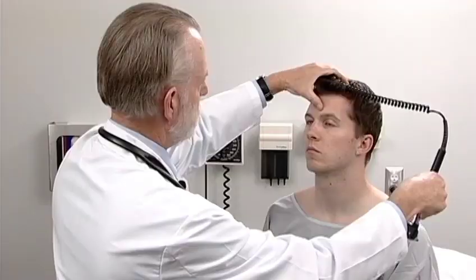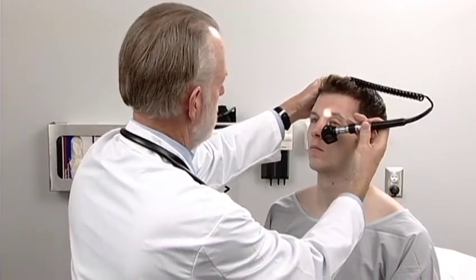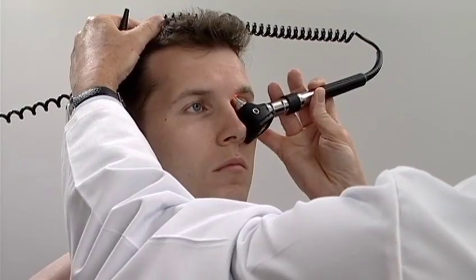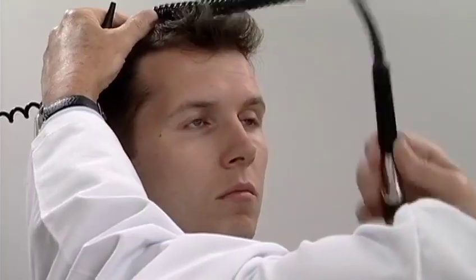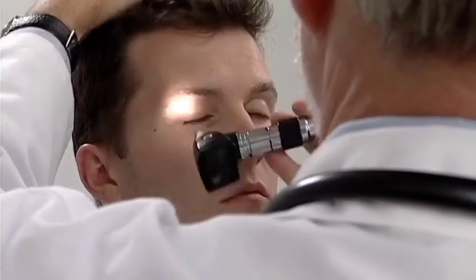Lastly, we can do transillumination of the sinuses. The fiber optic otoscopes are really quite good for this because they're cold and they don't apply heat to the patient. To transilluminate the frontal sinuses, you place the otoscope against the frontal bone and just at the supraorbital ridge, and you're going to inspect for light appearing in this area, and same on this side. Remember, asymmetry is very common.